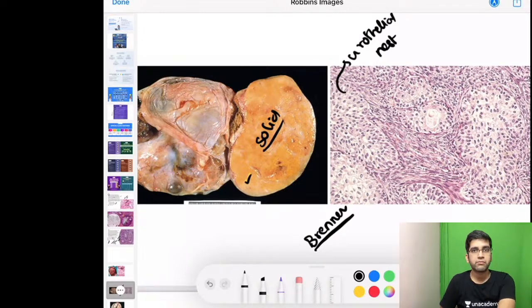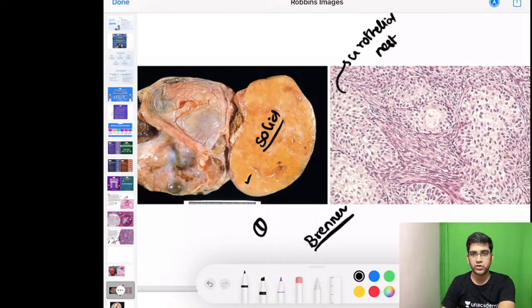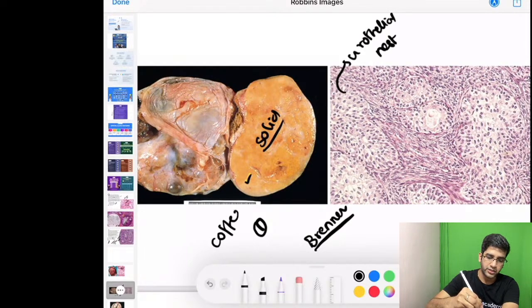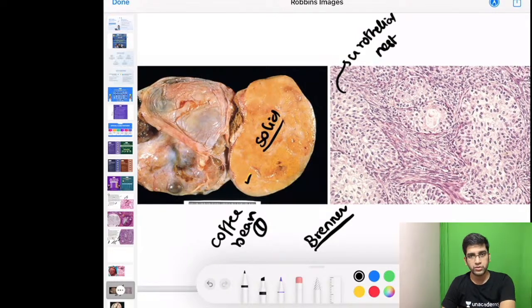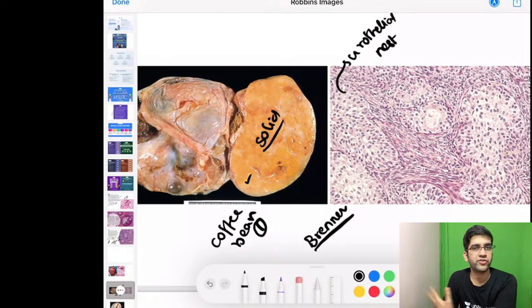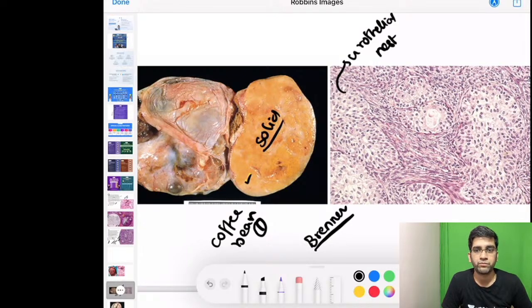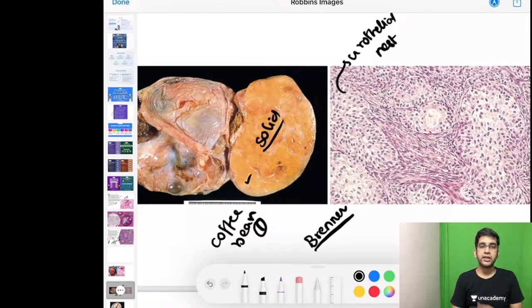Brenner's tumour can be benign, borderline, or malignant. On higher-power microscopy, the neoplastic cells show coffee-bean nuclei — classically characteristic of Brenner's tumour. Other tumours with coffee-bean nuclei include granulosa cell tumours, papillary thyroid carcinoma, and Langerhans cell histiocytosis.